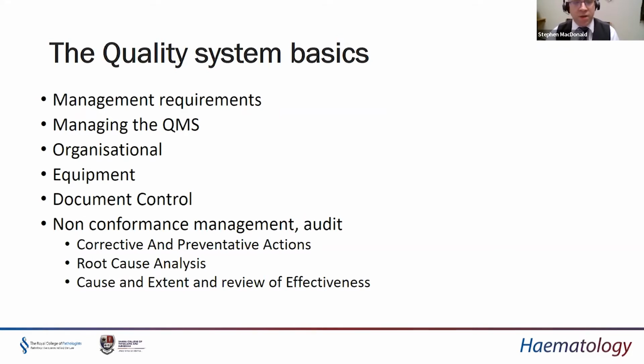And central to that is this thing which I will refer to throughout, called a QMS, Quality Management System. And that governs things like the organizational structure of the laboratory in conjunction with the clinical aspects, how we deal with equipment, procurement of equipment, buying equipment, maintaining equipment, having them on service contracts and various other things.